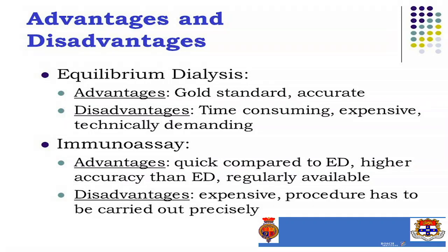There's advantages to immunoassay, there's time. The problem is we need calibration, and we need it calibrated to reference standard methodologies, and I think that's where HPLC is going to provide those methodologies that are going to allow us to standardise assays to measure the proper values and give us better clinical significance for a lot of these assays.